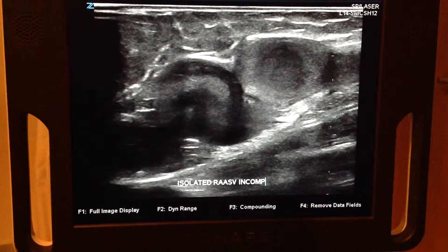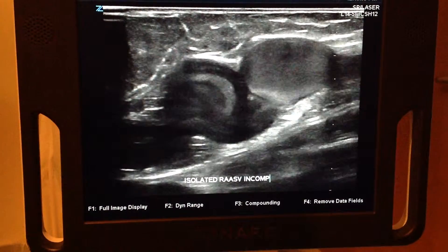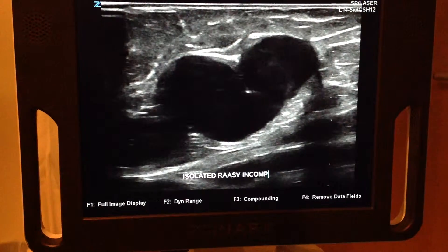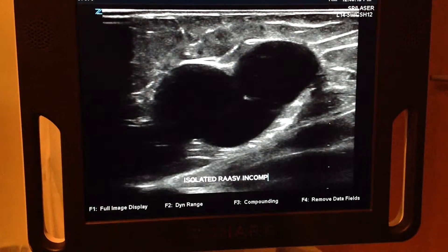This patient has an incompetent anterior accessory, which is what you're looking at. There is a valve in the middle which, as you can see, is not functioning well. There it is right there. And as soon as I let go, it fills right back up again.